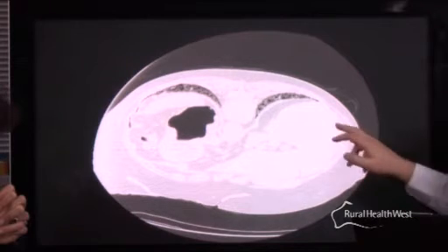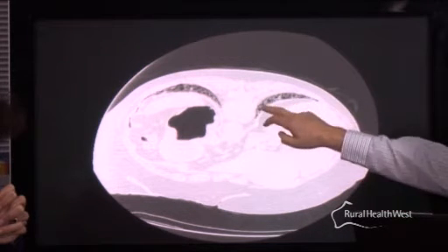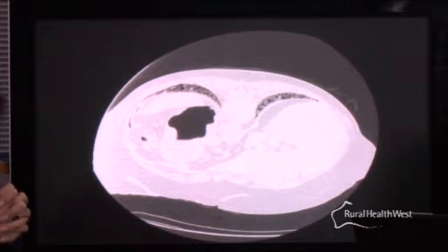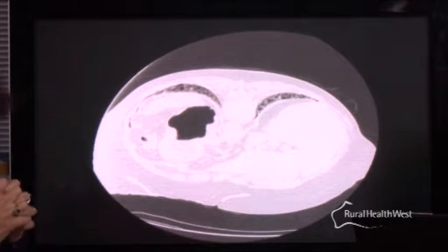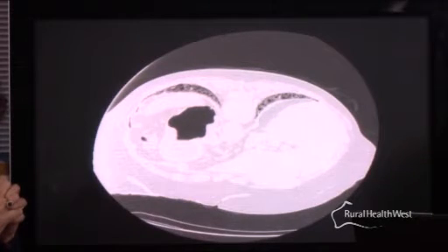So if we start at the bottom of the slides and work our way up, you can see that there is a honeycomb effect in the posterior basal segments of both the right and left lower lobes. And that honeycombing is really quite advanced stages of interstitial lung disease. Now, I'm unaware whether the patient has got a known condition such as rheumatoid or other connective tissue disorder which may be associated with interstitial lung disease. The majority of times when we see people with actual honeycombing, it is due to UIP.